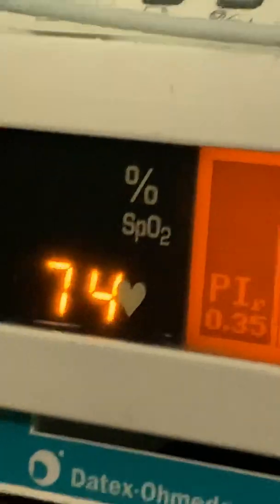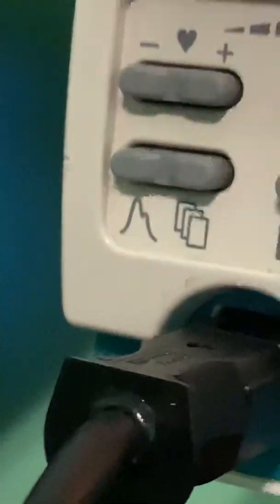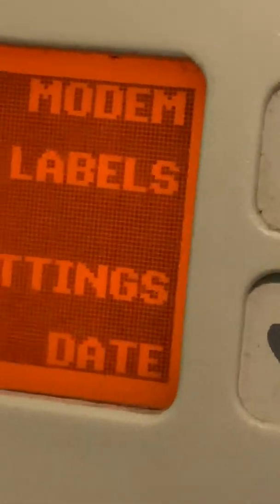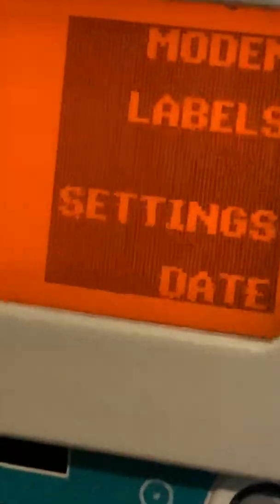Now I want to talk about these two bottom buttons. This left button is the waveform or home display. The right button is to get to these settings — you can hook this up to a modem, set labels, and label events.